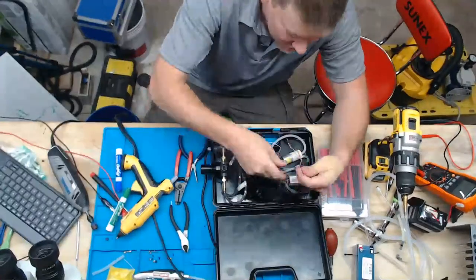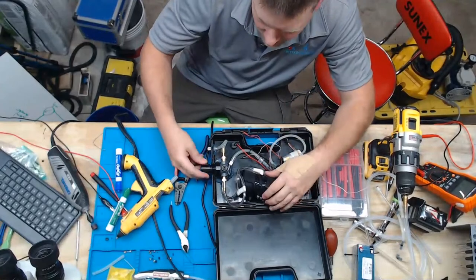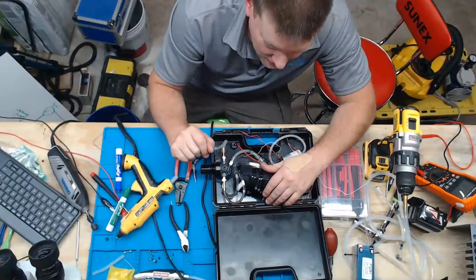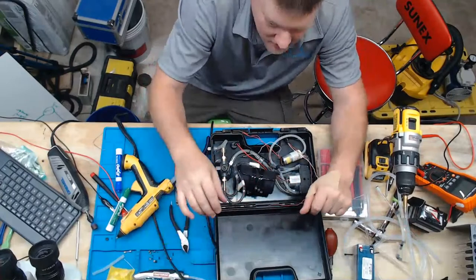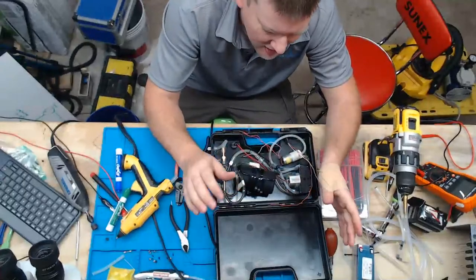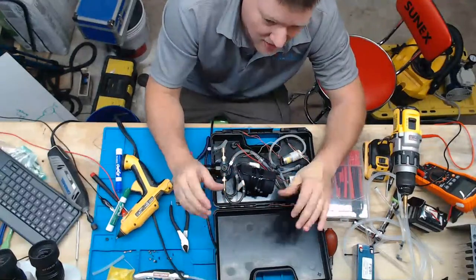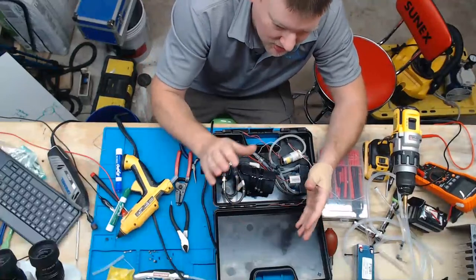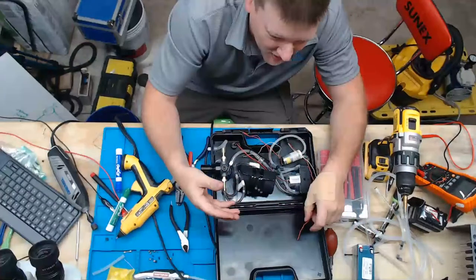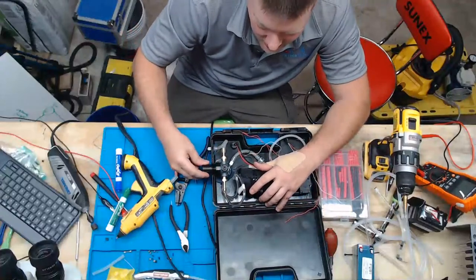No more of that. With this design, you turn the thing on, you just crank it to the pressure that you need on the manometer, and then you hit the accept button on your device under test. That's how almost all of them are nowadays. You'll have a display screen that says like calibrate pressure. And there's all sorts of medical devices that have pressure transducers, by the way. And you have to zero it. So zero millimeters of mercury. And they'll ask for like 100 or 200 millimeters of mercury. And we can do all that right here with this little 0 to 15 PSI regulator.